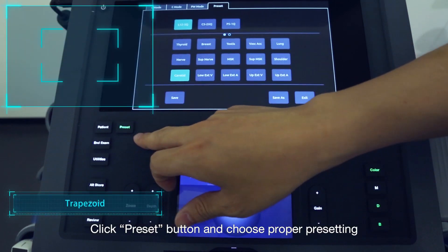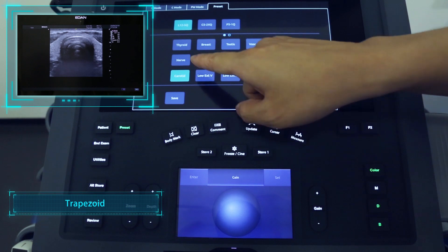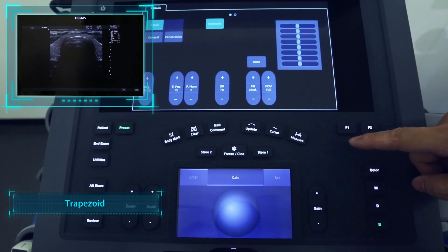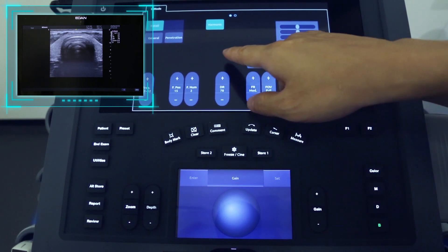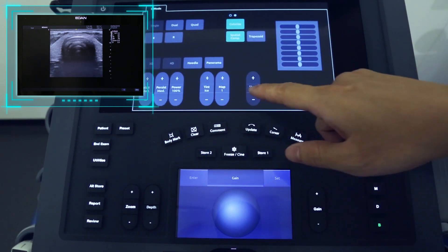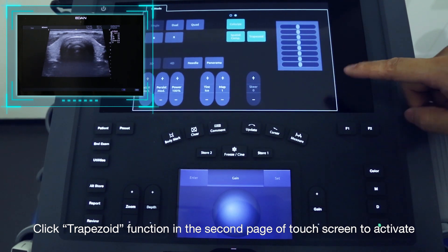Click the Preset button and choose the proper presetting. Click the Trapezoid function on the second page of the touchscreen to activate.